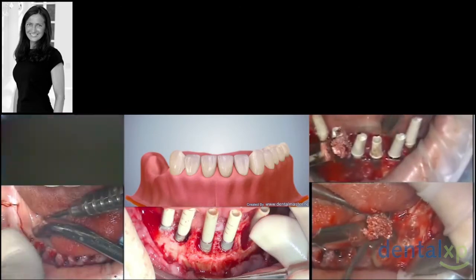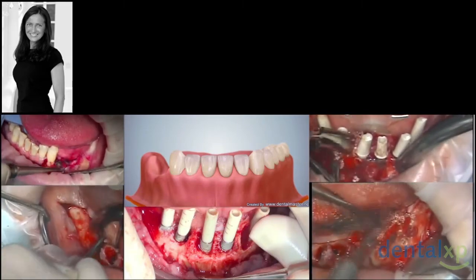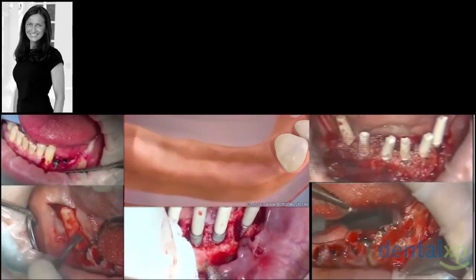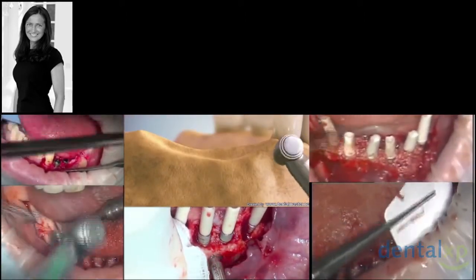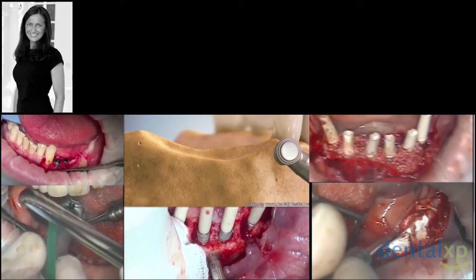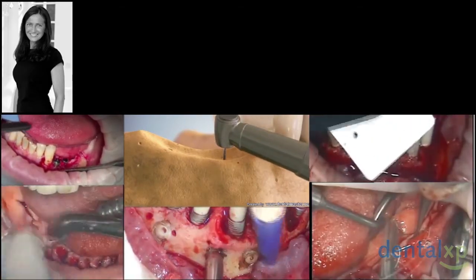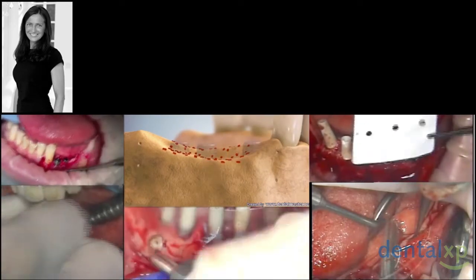And why I see the advantage there, I don't have to open the flap again. That is a resorbable membrane, which will resorb between 6 months and 1.5 years. And I can reestablish this defect and transform it into a 3-bony wall defect with a condition that mesially and distally I have a bone peak.